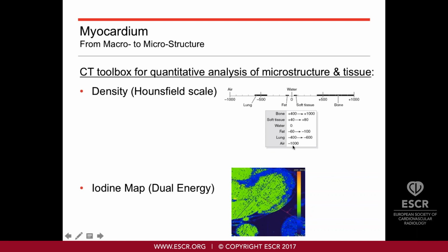If the T1 value is increased, we might consider fibrosis, diffuse fibrosis, focal fibrosis, amyloid. So we have a whole range of different pathologies, and if we combine this with the extracellular volume, this helps us to further distinguish these entities. Again, this is just a concept, but this is the idea behind T1 mapping, which helps us to distinguish different disease entities.